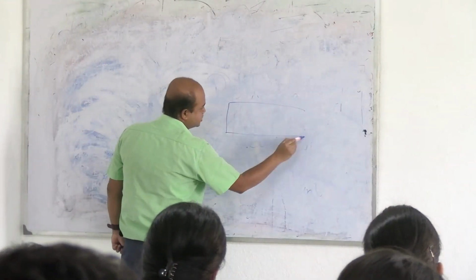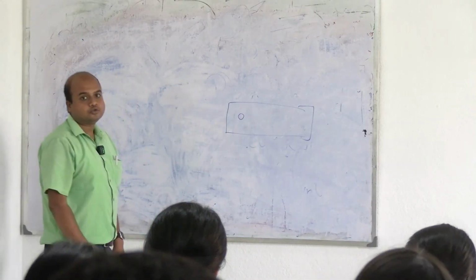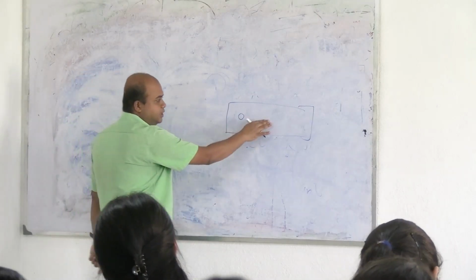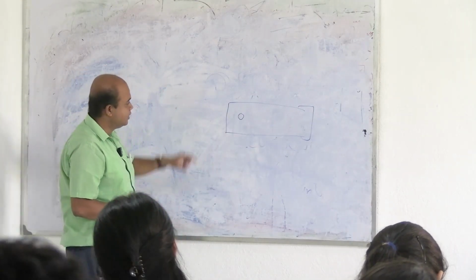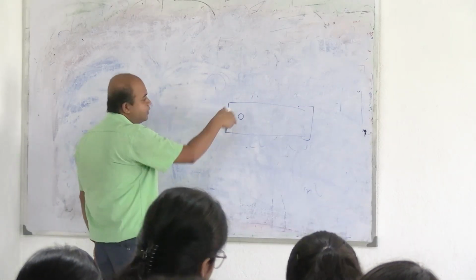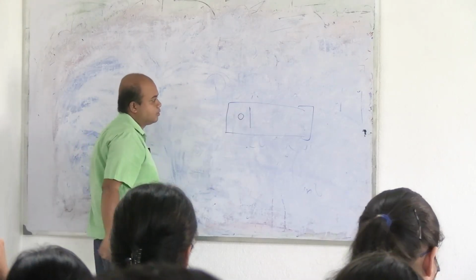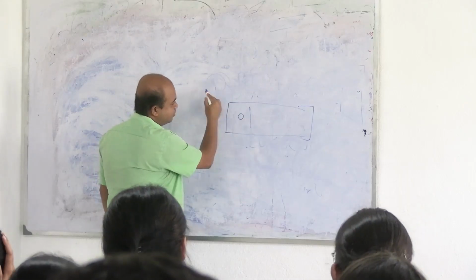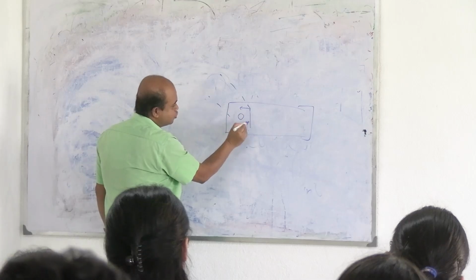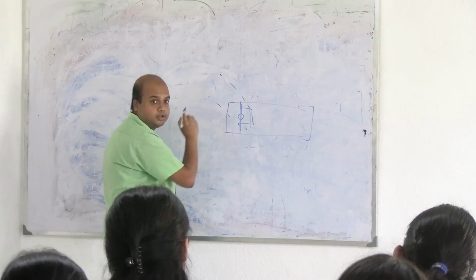This one slide will be placed on a horizontal surface. The blood drop maybe you have taken here. So the blood drop is to be taken near one end of the slide, not in the middle. And then you will put the slide which you have taken with your other hand just in front of it, at an angle of 45 degrees, and then just draw it backwards, so that this blood drop is spread along this edge.